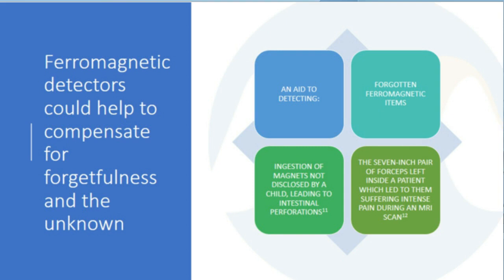to ensure a ferrous-free work ethos, where we are made to change to ferrous-free apparel, where even our glasses, footwear and underwear are ferrous-free. After all, if we go to a surgical theatre, we're asked to change to protect the patient. In MRI, changing to a ferrous-free uniform protects not only the patient, but everyone in the scan room.